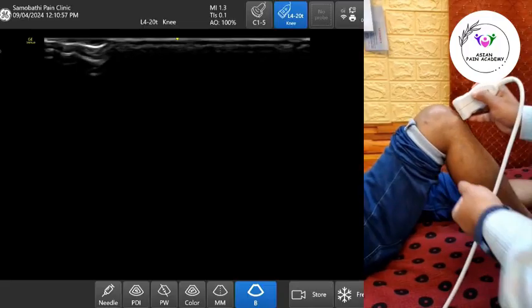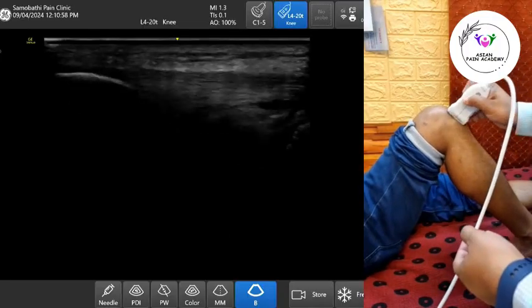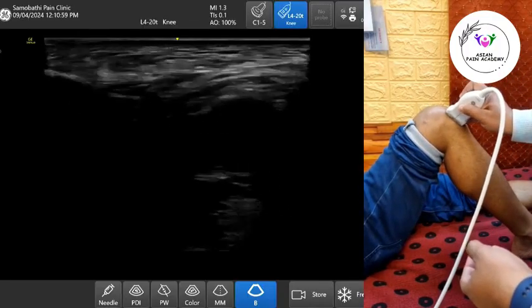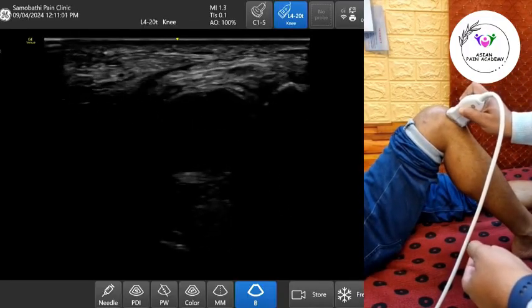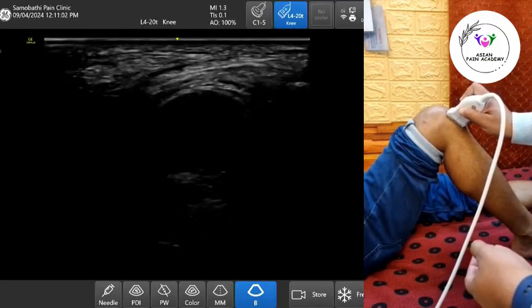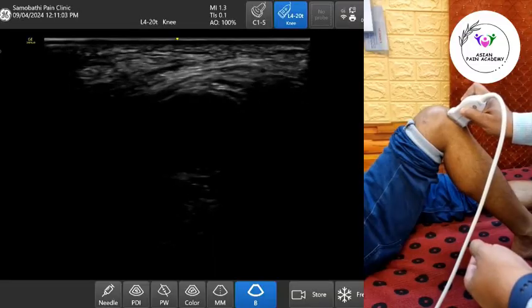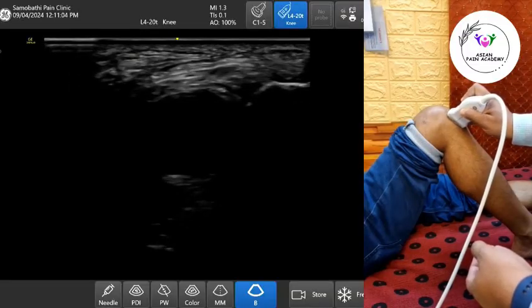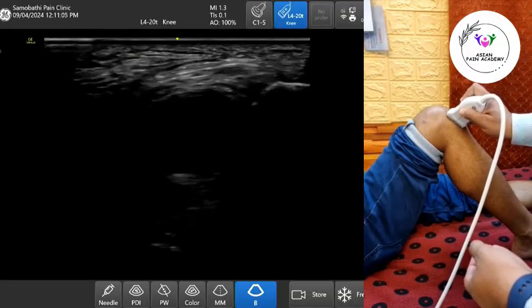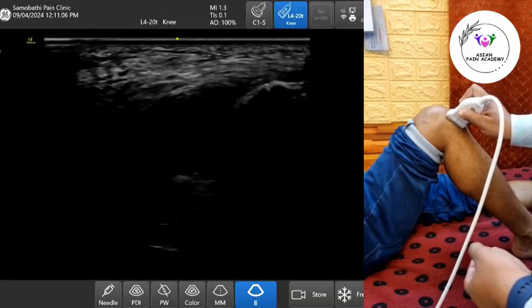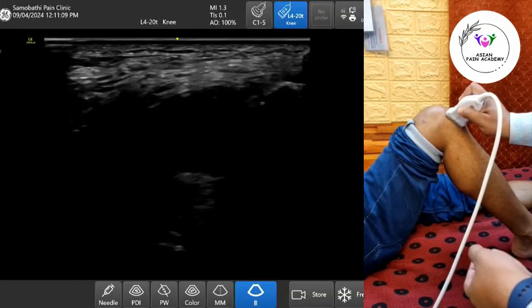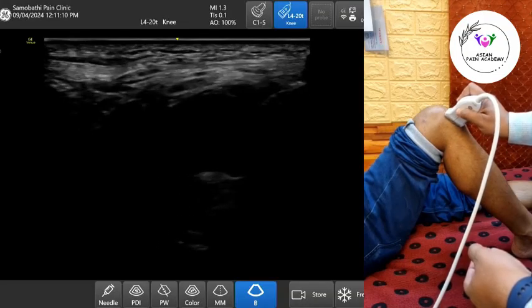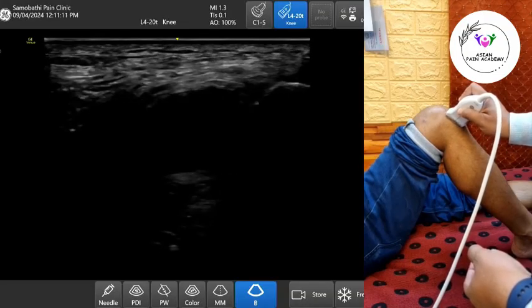Begin with a longitudinal scan along the patellar tendon. Identify the distal patellar tendon and tibial tuberosity, and look just deep to the tendon. A hypoechoic or anechoic collection may indicate fluid within the deep bursa.